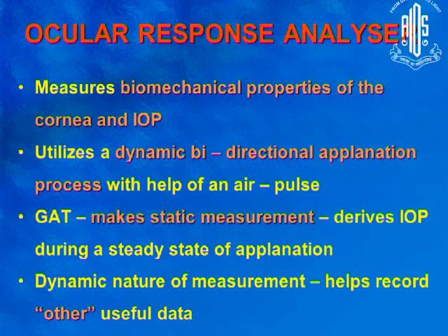Whereas with the ocular response analyzer, the cornea is not only flattened, but it is put into a state of concavity. And then it slowly gets back its original position. That is, it reaches a stage of flattening again and then gets its convex position. Therefore, the dynamic nature of the measurement helps to get other important data.